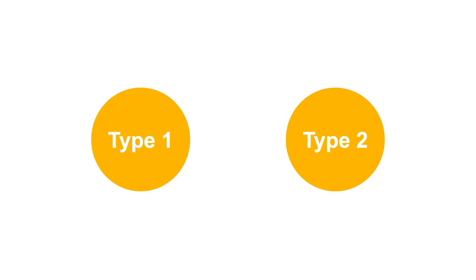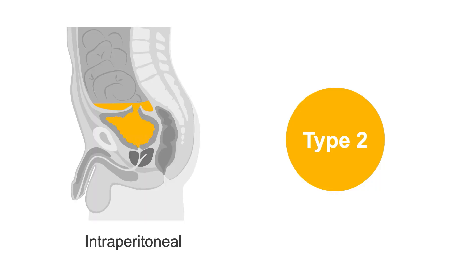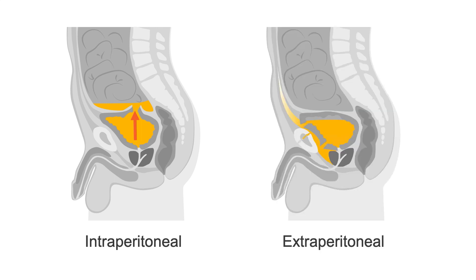Bladder injury is characterized as one of two types: either intraperitoneal rupture, which involves the dome and causes urine to spill into the peritoneal cavity surrounding the bowel loops, or extraperitoneal rupture, which is usually anterior and the leaking urine is confined to the space surrounding the bladder.